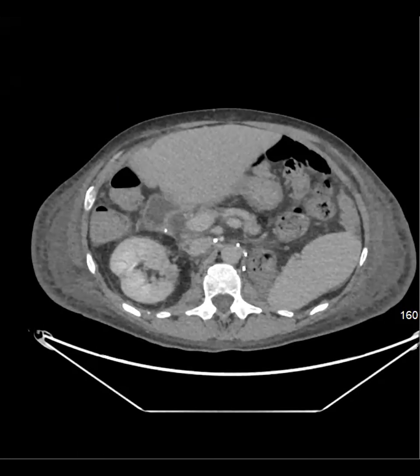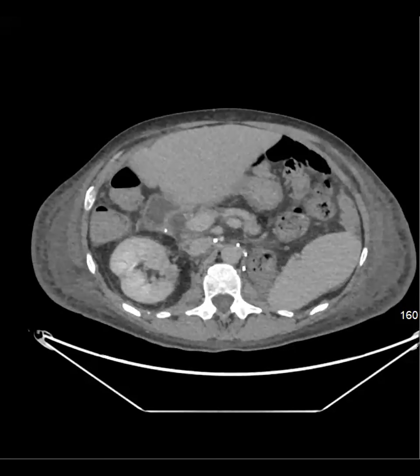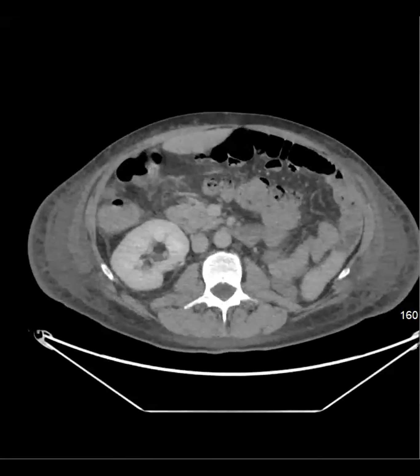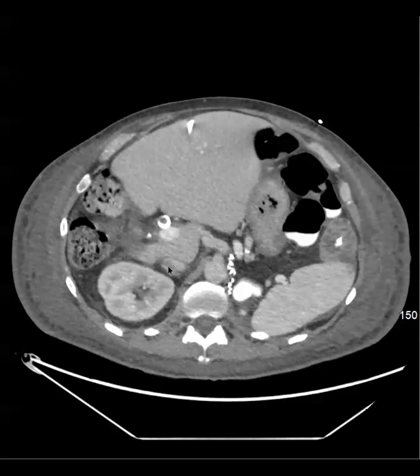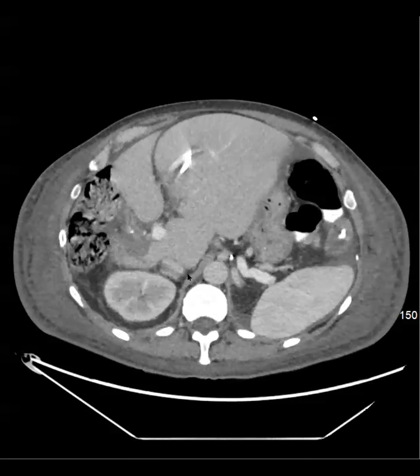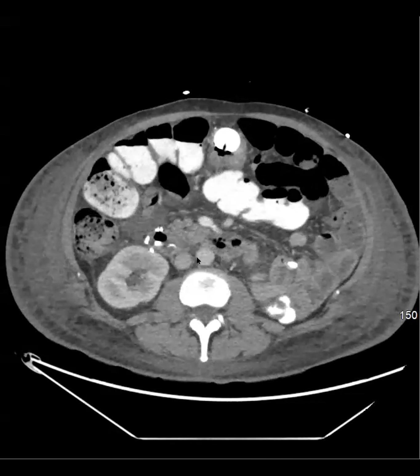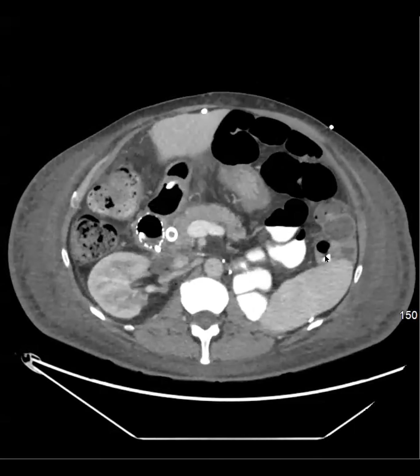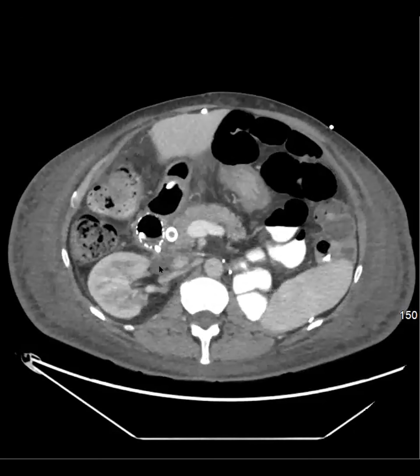Sorry about that. There's stuff in the left renal fossa too. Is that post-op? No, this is bowel. Oh, just bowel. Sorry. So this is the follow-up where, based on the report, it looks like they took out some of the IVC clot with angio, and then they placed a duodenal stent, and then they crossed the level of obstruction or fistula with the tube, and you can see that there's a little bit of this remaining and a little bit of clot remaining.